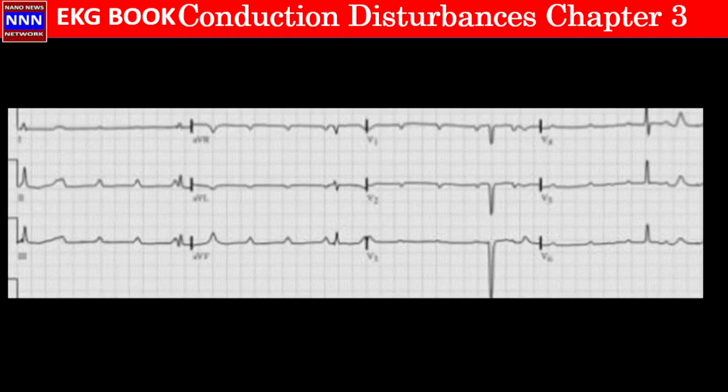Okay, what are we looking at here? These are actually P waves, so I don't want you to confuse these to be like QRS complexes. Here's one QRS complex, here's one complete QRS complex, but the rest of them are P waves. So you're looking at a complete heart block with practically no QRS complexes, maybe one here, and one here. And here, this is maybe an example of a fusion beat. And this is an abnormal QRS complex, but this QRS complex is different. And this could be a fusion beat. So here we are dealing with a complete heart block.